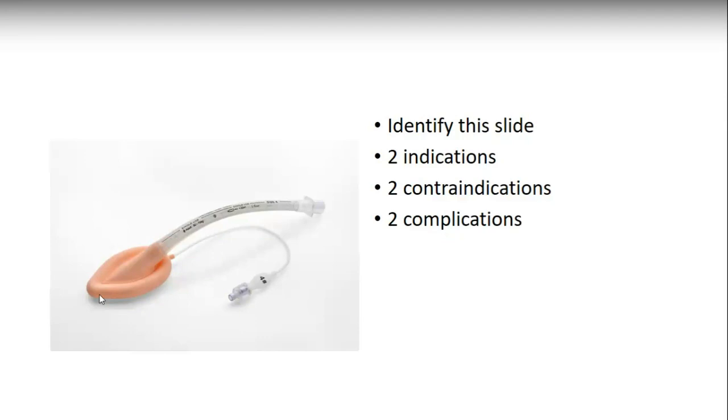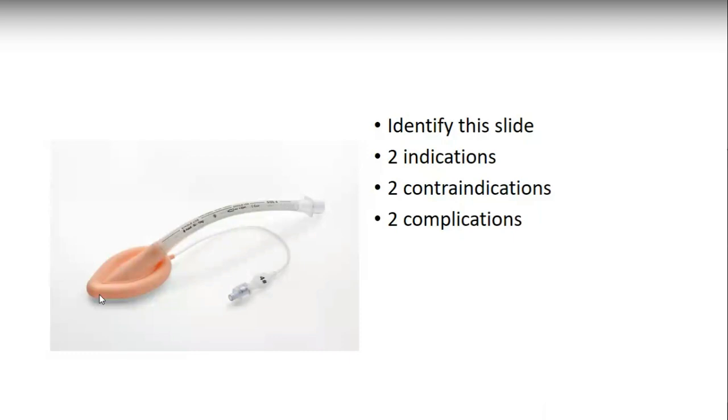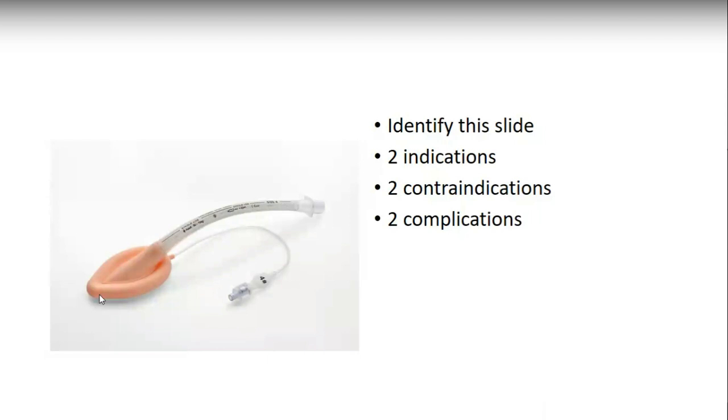Okay, so what is this slide? Can someone identify what this is? Can it be intubation tube? Max. Okay. Endotracheal. Laryngeal airway. Sorry? Laryngeal mask airway. Correct. That's it. That's laryngeal mask airway.